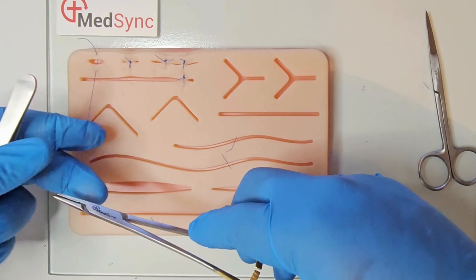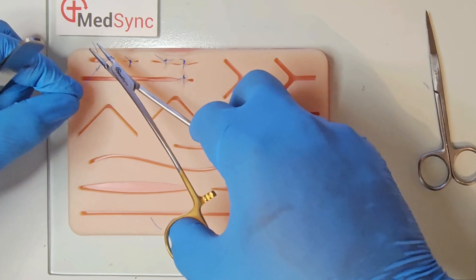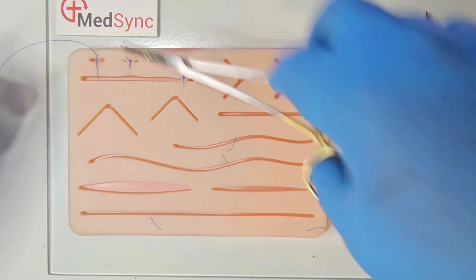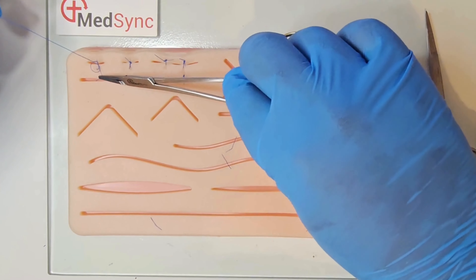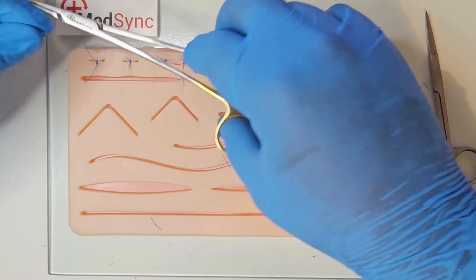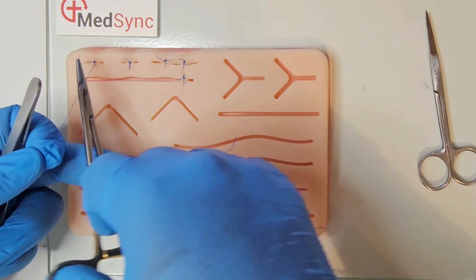Perform your surgeon's knot first. If the wound re-opens, continue with your standard reef knot, but pull the short thread back to where it came from. Do not pull the long thread until you have the desired approximation. Complete this by performing one final reef knot.